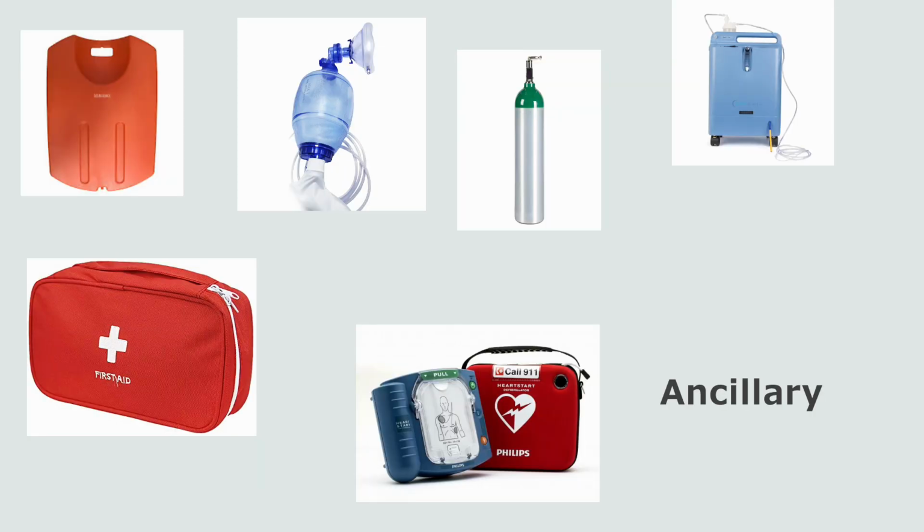Other supporting items you will need are like a CPR backboard when patients are in bed. You need something to push down against, or you'll just be pushing the patient into the bed and not giving good compressions. A bag mask for CPR should also be available, as should an AED machine and a fire extinguisher. The AED machine has batteries and sticky pads, and they need to be replaced if they get past the expiration date.